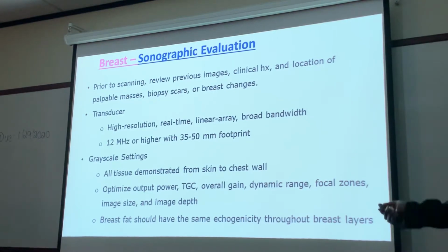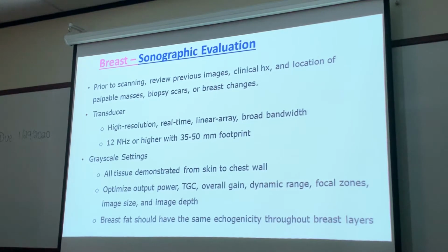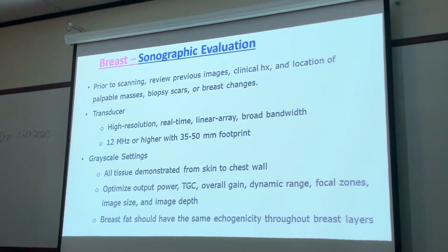Okay? So review those previous images and that clinical history, because a lot of times you're comparing what we're discovering right now with the ultrasound to the mammogram. We know that sometimes breast cancer can be progressive and can advance very fast, so you want to compare what we did last time to what we're doing right now. Pat, I know you do mammo. Feel free to jump in if you have additional information.